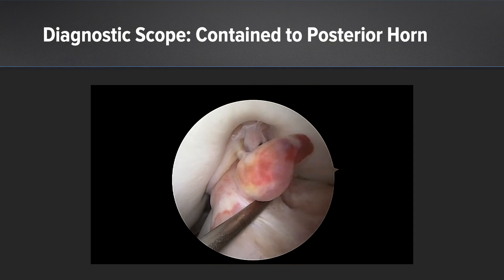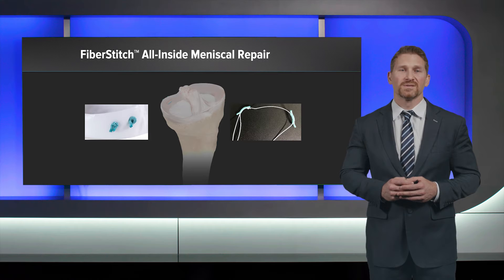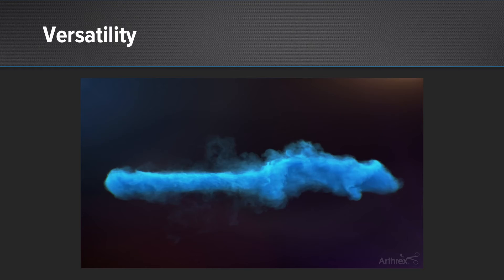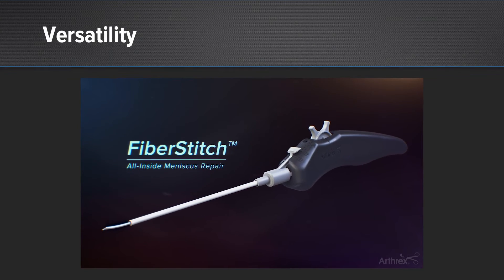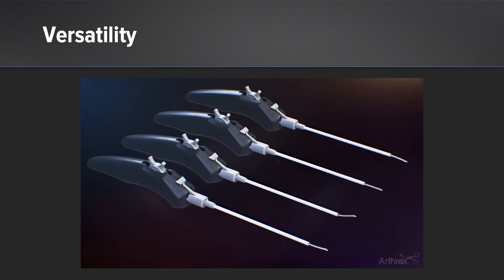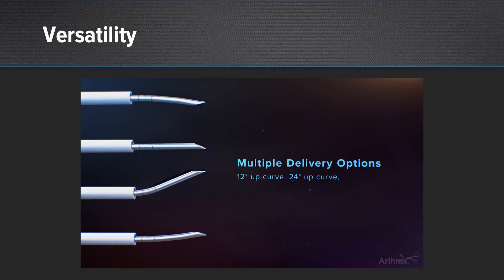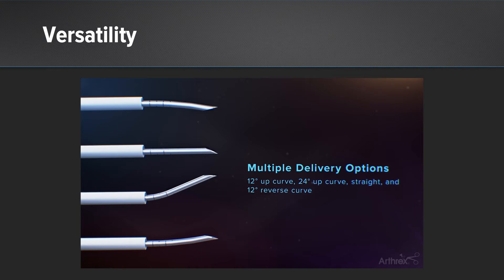I'm going to apply an all inside approach to repair, using the fiber stitch all inside meniscal repair device. In particular for this case, what I like about it is versatility. This is a tear where I really want to place stitches both on the top and the bottom of the meniscus. With the straight, 12-degree, and 24-degree up curve options, as well as the reverse curve options, I know I'll be able to accomplish that going into this case.